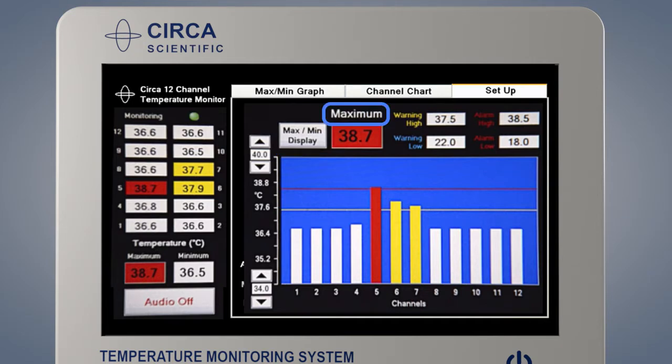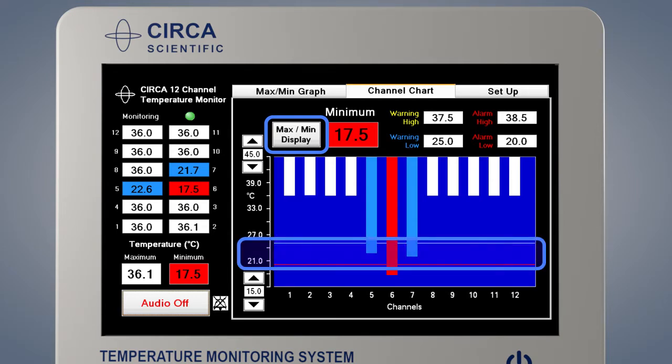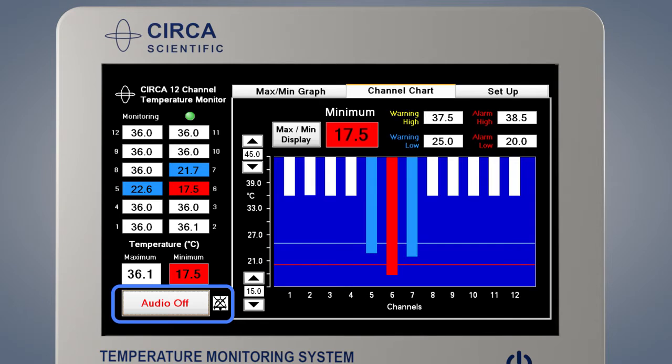If the word maximum is displayed, the graph will display the high warning and alarm limits and the highest temperature will be displayed. This is used for heat-based procedures. Press the max-min display button to change the orientation of the graph for a procedure in which the temperature is expected to get colder. The word minimum will be displayed and the coldest temperature will be displayed. The chart will display the low warning and alarms with a blue and red line. This is used for cold-based procedures.